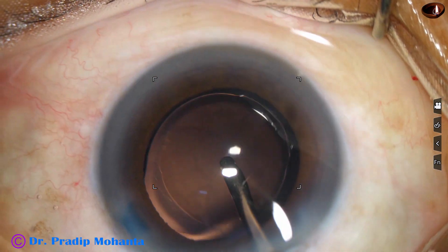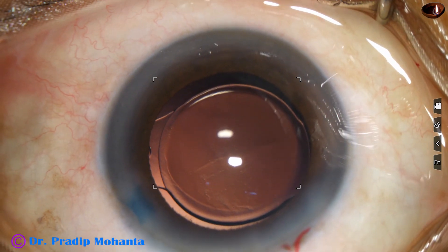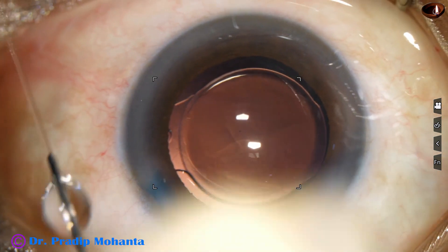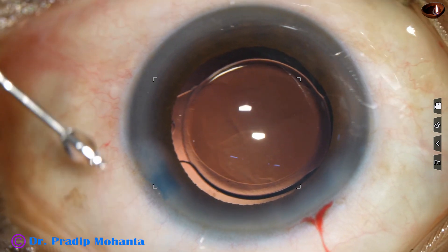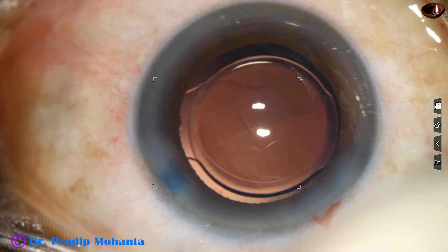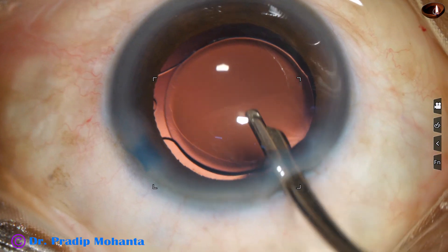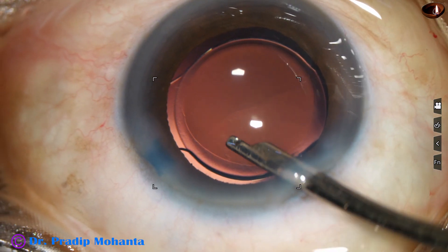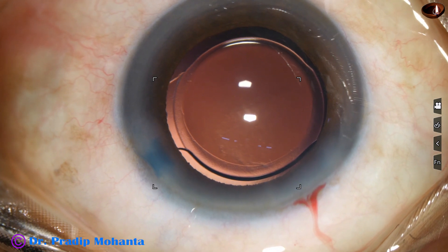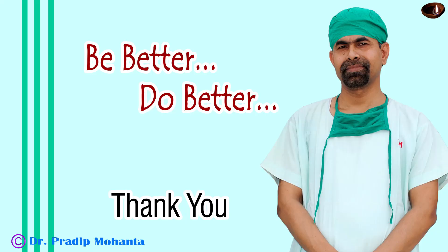The irrigating probe is introduced through the main wound, and whatever viscoelastic is there in the lumen of the cartridge comes out. A bit of moxifloxacin is injected. Then the side ports are closed by hydrating the corneal stroma. A final lavage is done and the anterior chamber is nicely formed. Integrity of the wounds is checked — there is no leakage from any wound. A few drops of moxifloxacin are applied and the case is concluded.